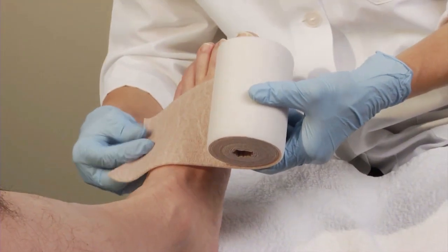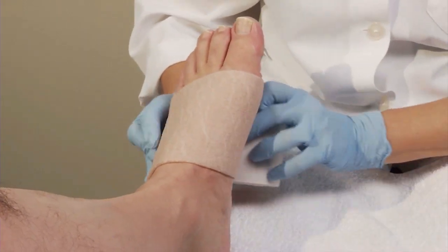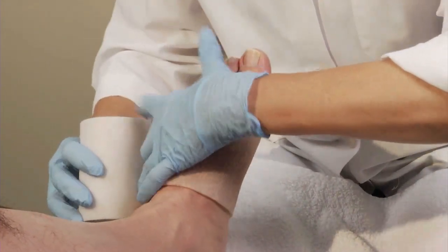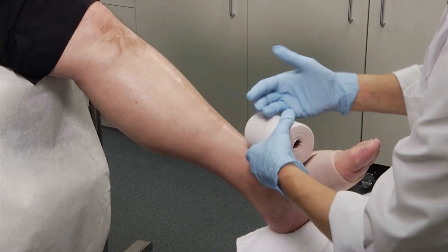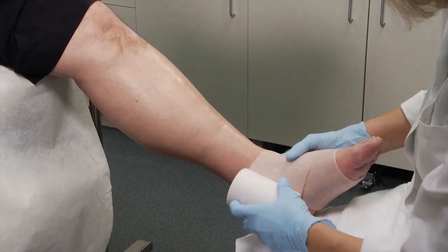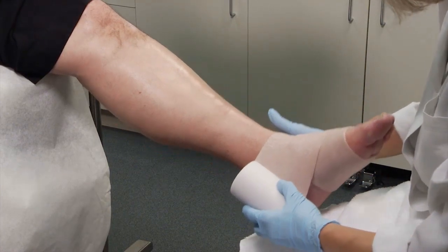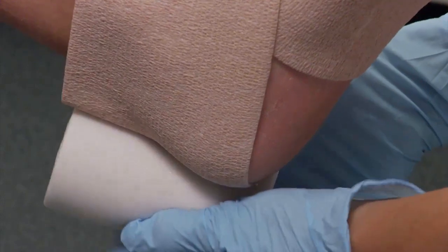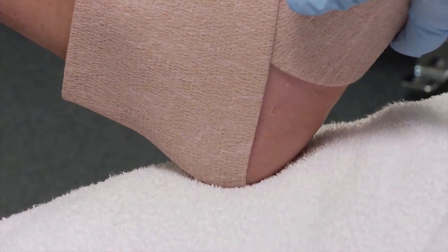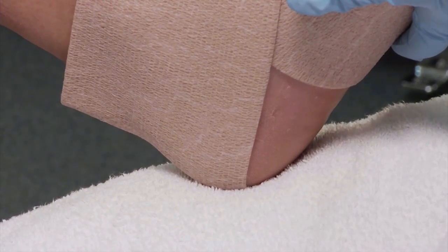Start the application of the comfort layer with a circular winding at the base of the toes, beginning at the fifth metatarsal. This technique provides neutral comfortable foot alignment. The second circular winding should come across the top of the foot so that the middle of the bandage width approximately covers the articulating aspect of the ankle joint. Bring the next winding around the back of the heel so the bandage edge is even with the bottom of the foot. Imagine that if your patient was standing, the edge would just dust the floor.